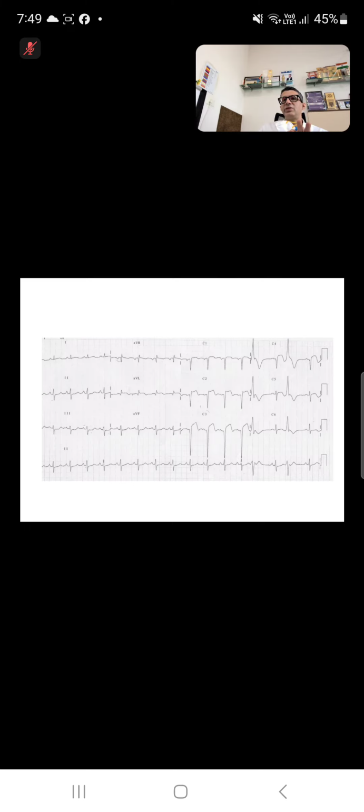Most of the time, you will find this ECG if the patient had pain about 2 or 3 days back and has now come to you to find out why exactly he had that pain. Then it's different. You don't rush with angiogram or primary angioplasty. So the clinical situation of the patient is extremely important.